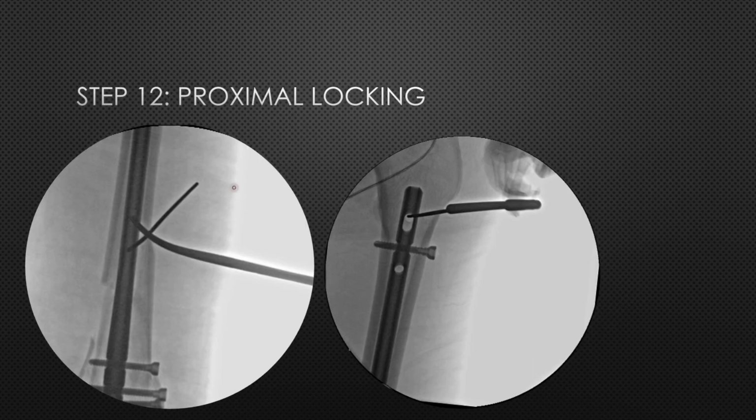Now before committing to the proximal locking, again check the length. The length should be perfect, because if the nail length is not perfect, you are bound to have some shortening of the limb. That might not be significant, but you have to avoid that. You can place either of the 2 screws first, but preferably the screws should be in 2 different planes, just to add more stability. So we have used 1 lateral to medial screw and 1 anterior to posterior screw.